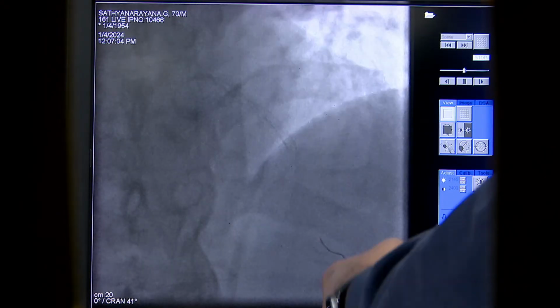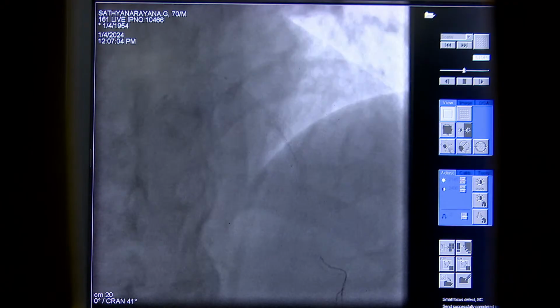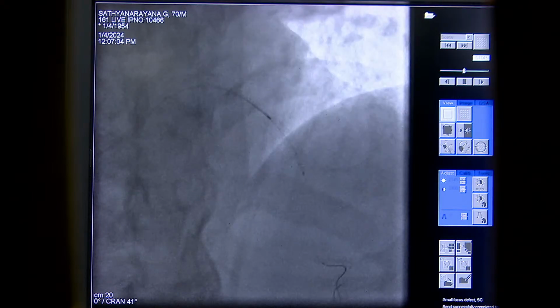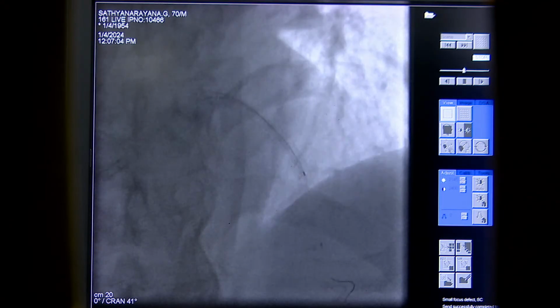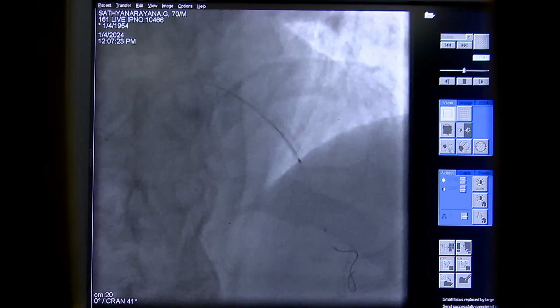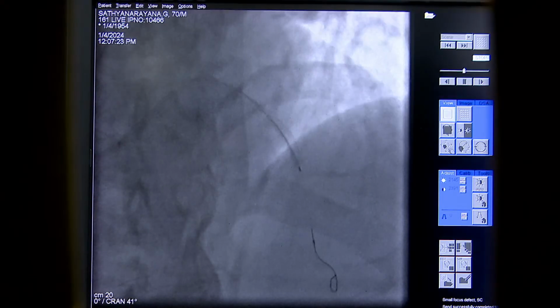It's okay, keep it there and put the OCT catheter. Go down. Still you can. That's fine. Slightly pull the wire. Avoid the pressure on the distal tip. Slightly pull the wire. That's fine.